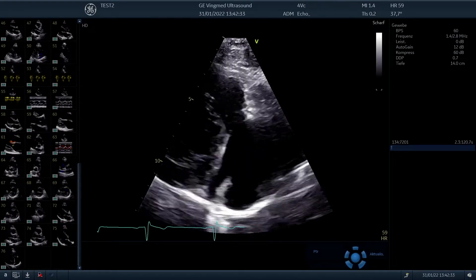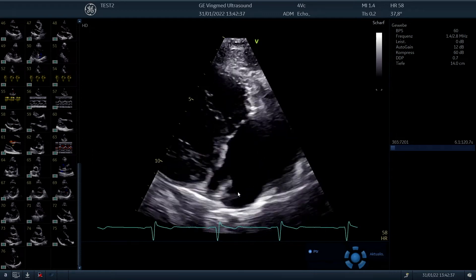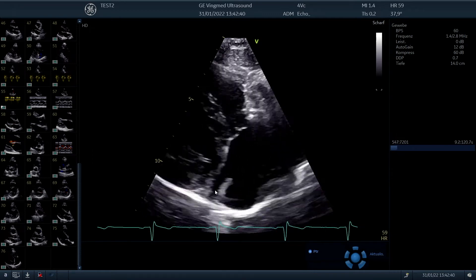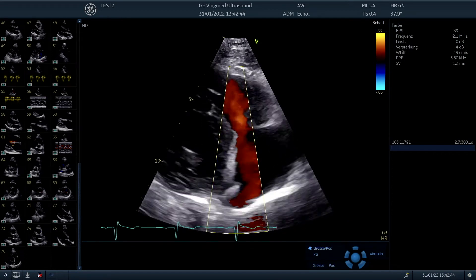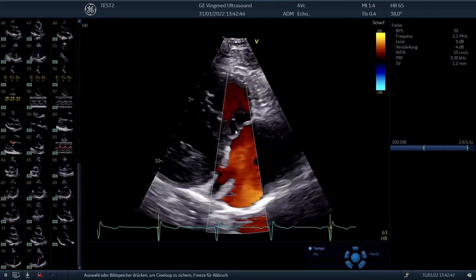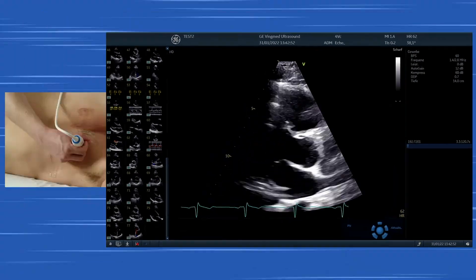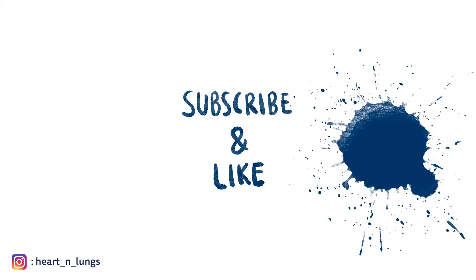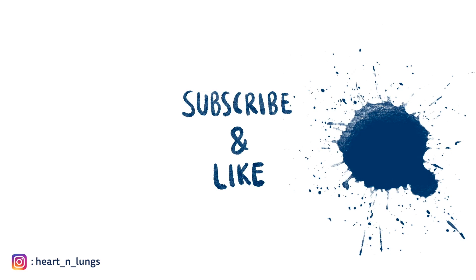In detail we can differentiate here the IVC entering here in the right atrium and here the coronary sinus. We can also apply color Doppler to see if there is tricuspid regurgitation, as well as we can denote the inflow of the inferior vena cava and the coronary sinus.